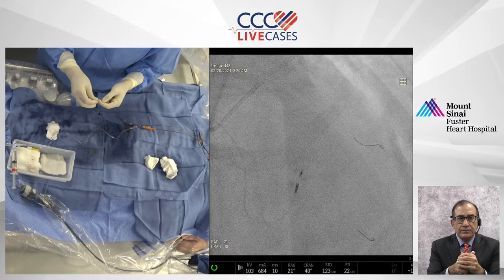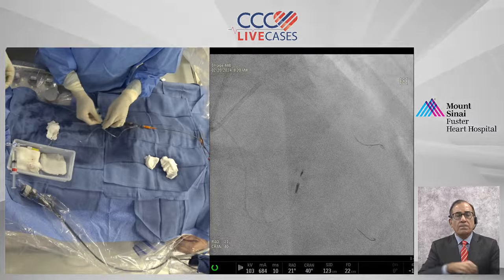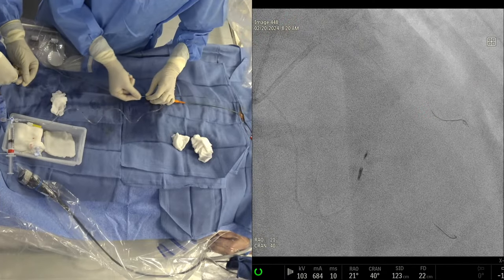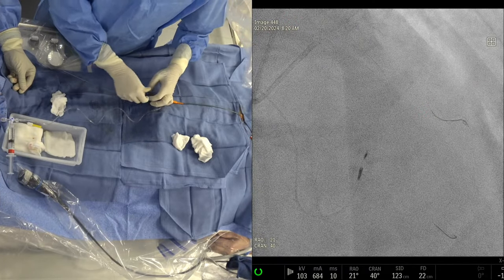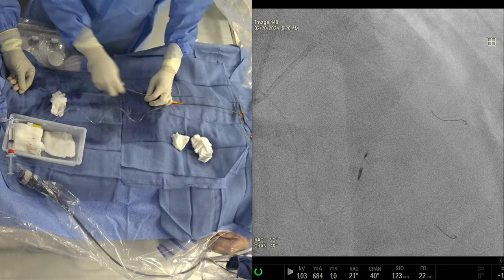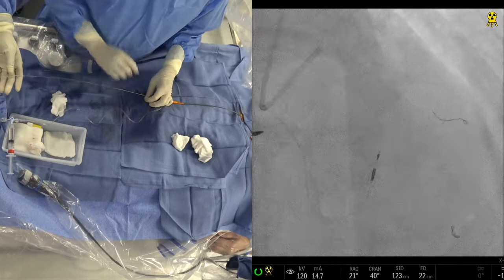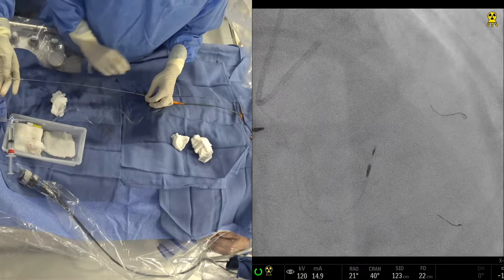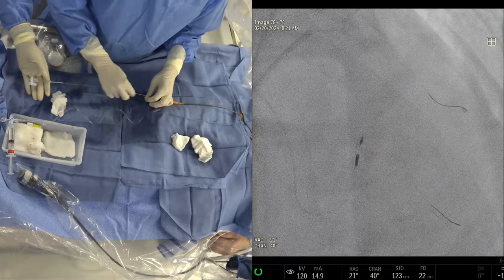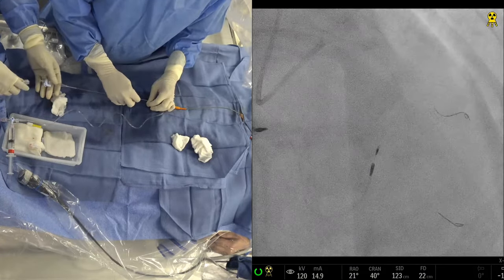Second, when I saw this picture, which was just done 2 weeks ago, I said, this is a beautiful case of demonstration, knowing that both vessels needed to be done. We did the RCA, the patient went home, and then was brought back for this diagonal bifurcation. Because of the educational importance of this kind of lesion, because we encounter these cases rarely, but it does happen, I said this will be a good case to showcase. And that's the reason.